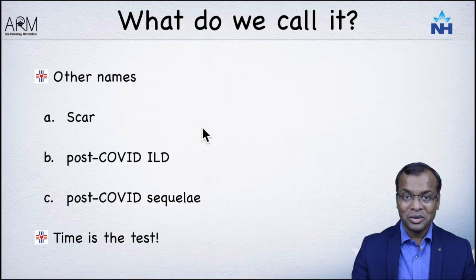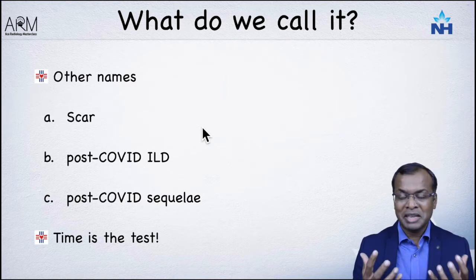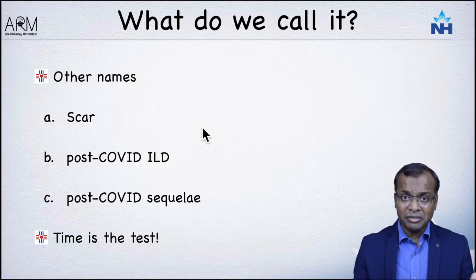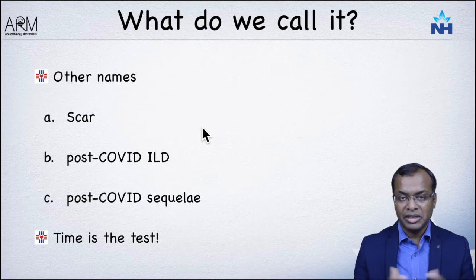It's easier to just call it post-COVID fibrosis and bundle all of this together, but it may not be very simple as that, because we have been giving some of these patients antifibrotics over the last year. Some of them have responded very well, but we do not necessarily know if they responded secondary to antifibrotics or they may have responded well anyway.